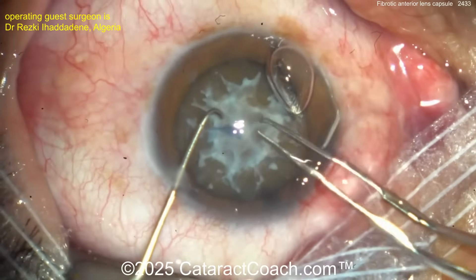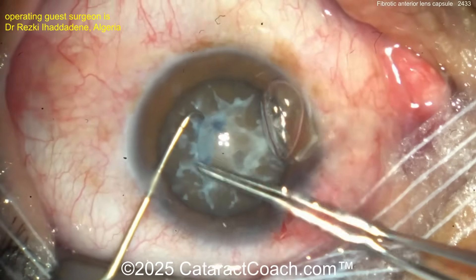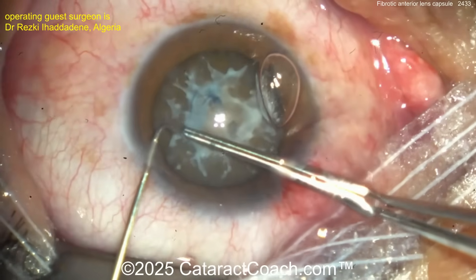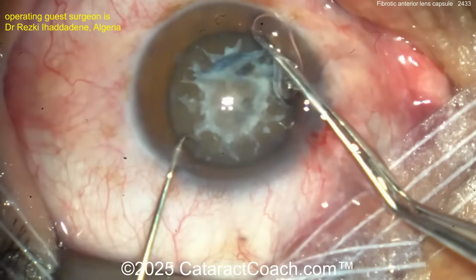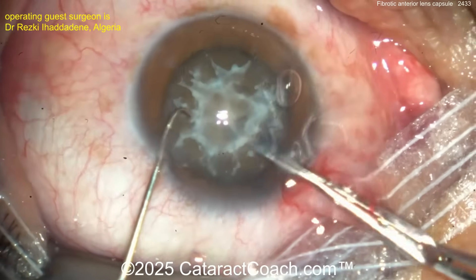That fibrotic membrane can often be peeled away from the undersurface of the anterior capsular edge. Look at that — wow, it's a pretty reasonable-looking rhexis! I like it a lot. Now because it's brunescent I'd make a nice, juicy, generous big rhexis — but wow, that is fantastic. Sometimes it's not that easy.